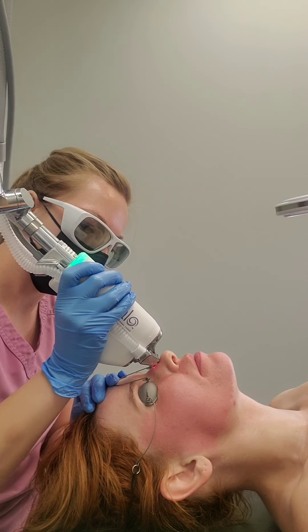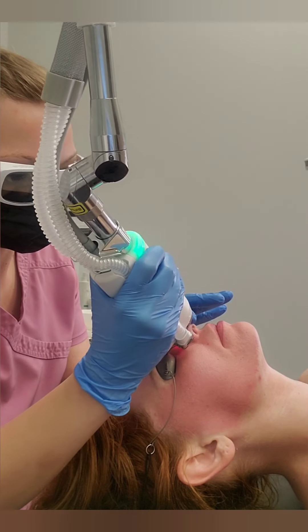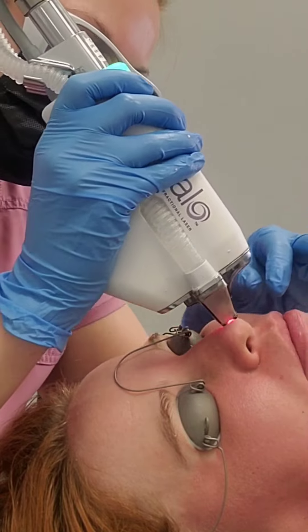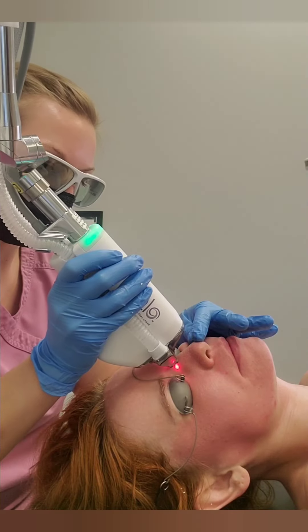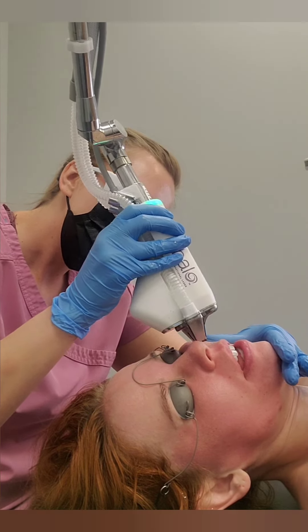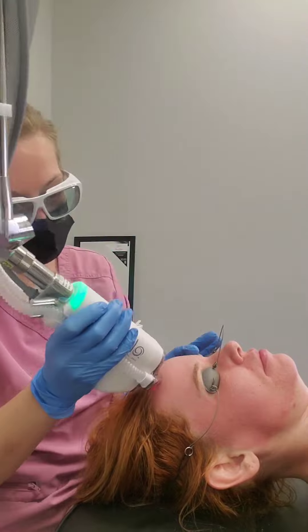It's pretty obvious my patient is very comfortable. This is a long-time patient of mine — I've seen her for nearly five years. She typically does microneedling and actually wanted to do microneedling with PRP during this appointment, but I introduced her to the new Halo device and she was all about it. She likes to do microneedling as a preventative rather than injectables. I personally choose that route myself — laser, microneedling, chemical peels — as alternatives to aging, focusing not just on wrinkles but on texture and the overall health of the skin.